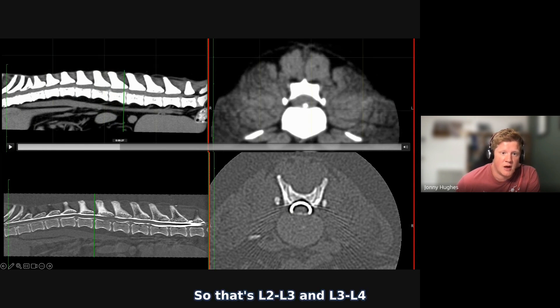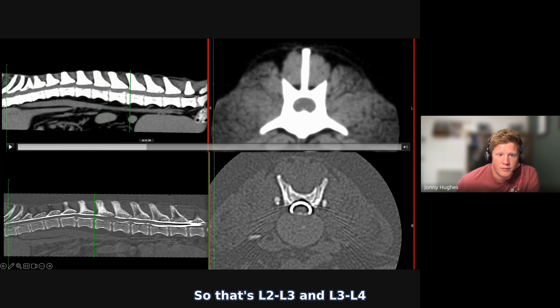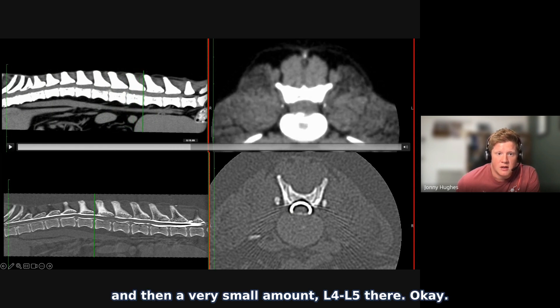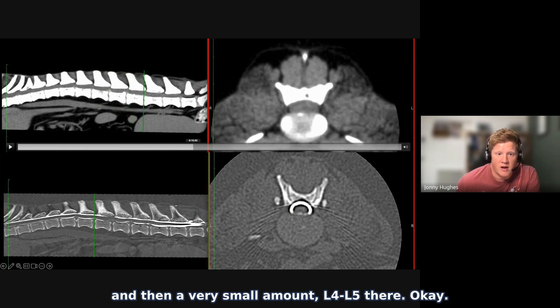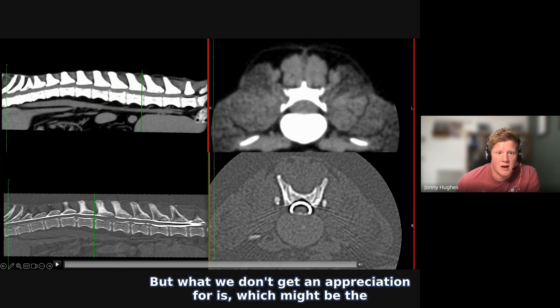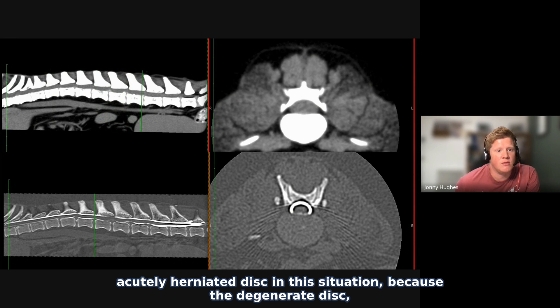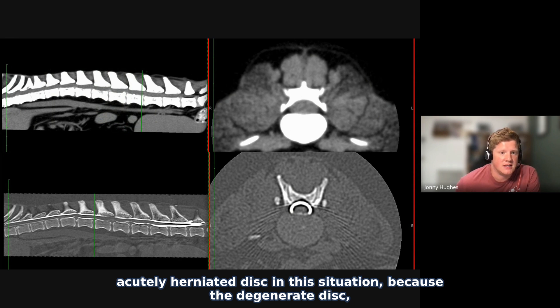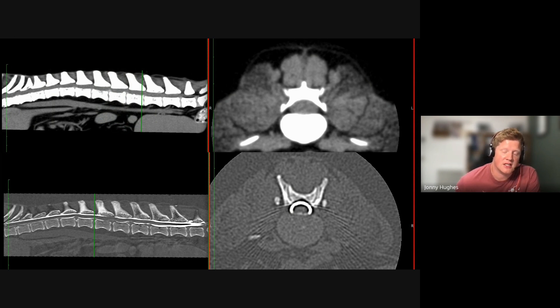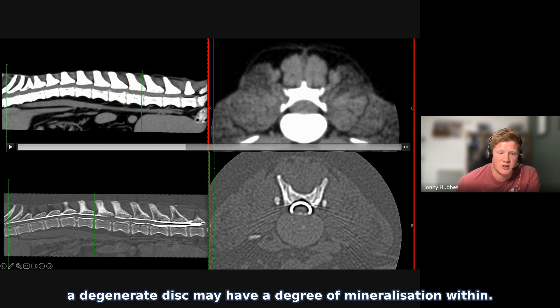The disc herniations are at L2-L3 and L3-L4, and then a very small amount at L4-L5. However, what we don't get an appreciation for is which might be the acutely herniated disc in this situation, because a degenerate disc may also have a degree of mineralization within it.